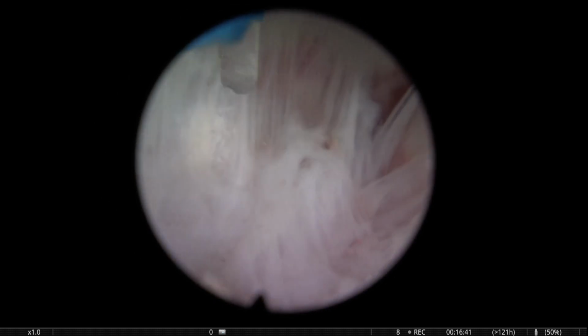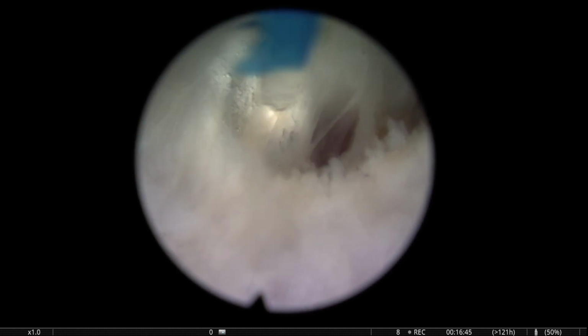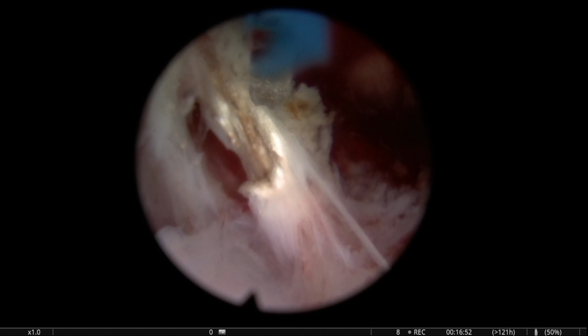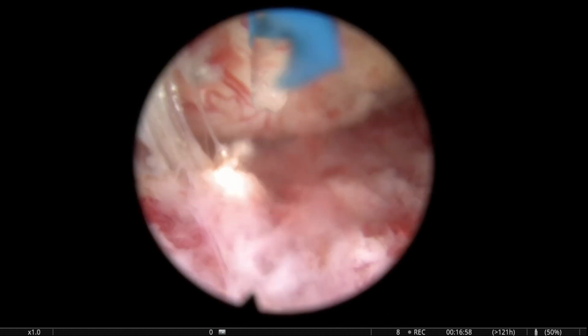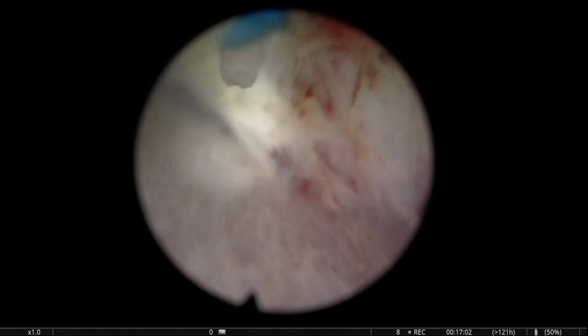And of course, many times we don't have the ideal prostate. We have, let's say, the difficult planes or the inflammatory prostate, so we have to get used to this concept. We look for a capsular plane. Not always it's going to be beautiful.